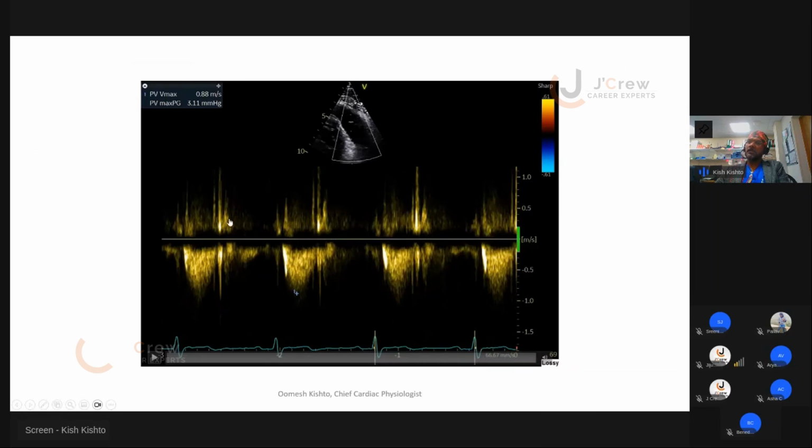And you guys can see how I've optimized my Doppler. It's nicely spaced based on the horizontal speed, and so that way you have a clear definition of the Doppler where you can measure. Okay, so always optimization is good.